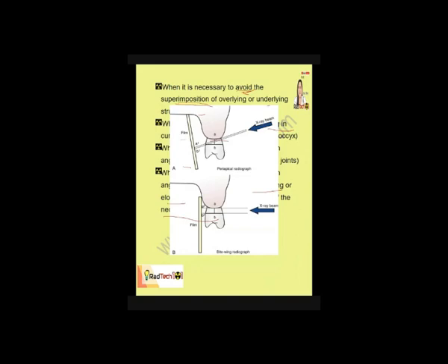So, I have here examples of angulation. So, kapag ito yung ating central ray diretso lang, so hindi masyadong makita yung structure dito. Kasi diretso lang. Unlike kapag nag-angulate tayo, mas makikita natin yung structure dito. So, ganun ka importante yung angulation. So, this is the exposure of a tooth.